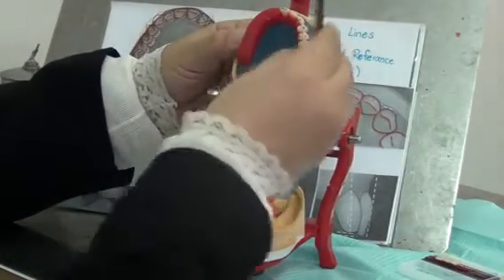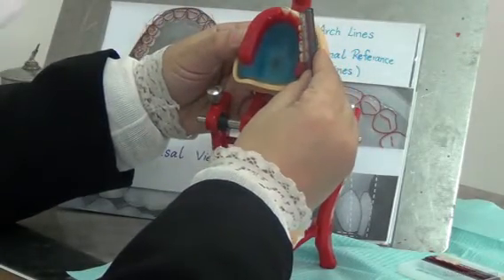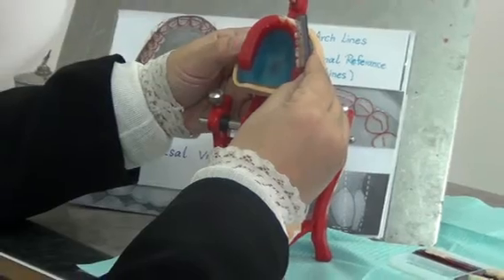We also have, if you look closely, the central fossae of the teeth, which are all in one line. So let us revise those lines on the drawing here.